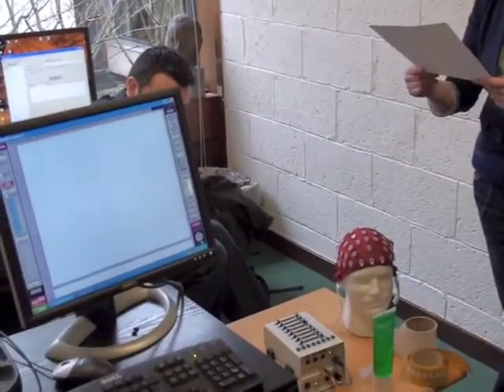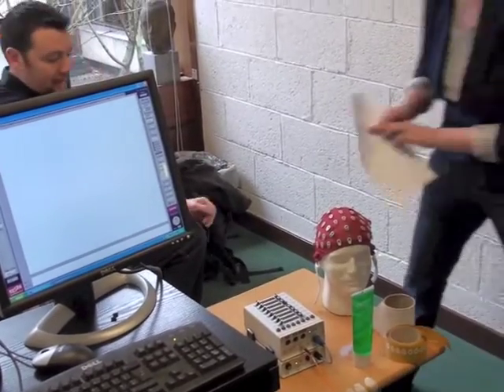Okay, so now I'm going to put the cap on. Is that alright? Yeah.